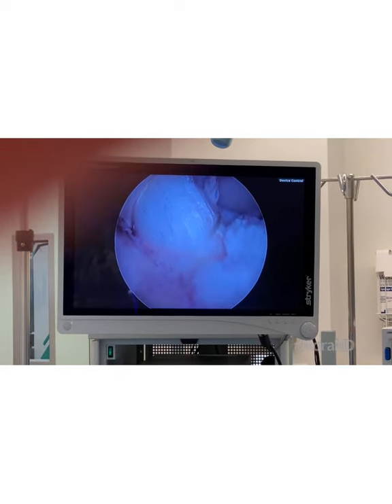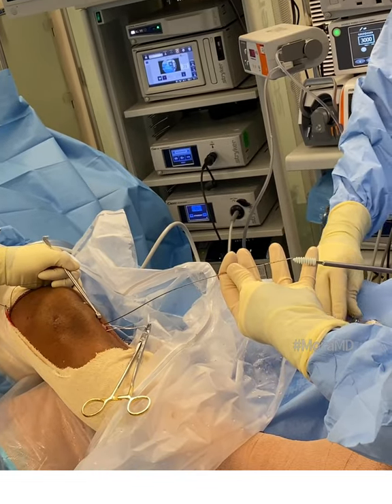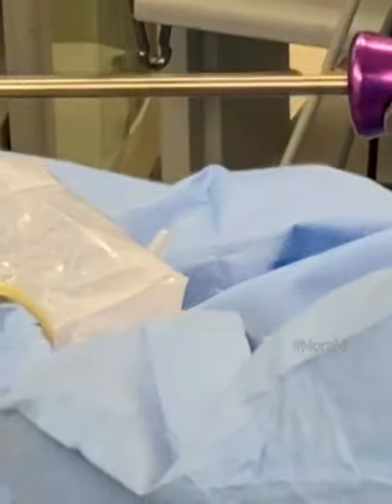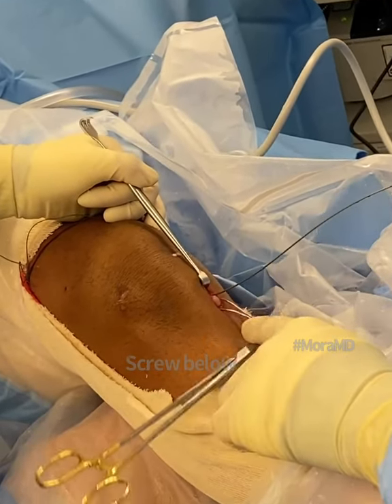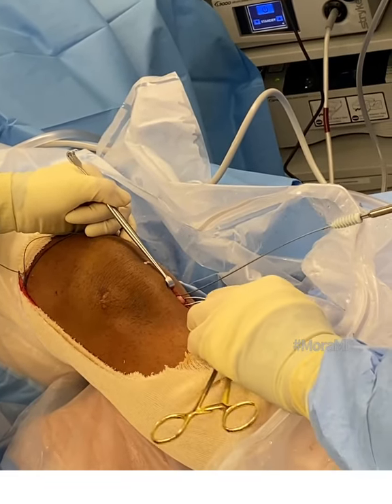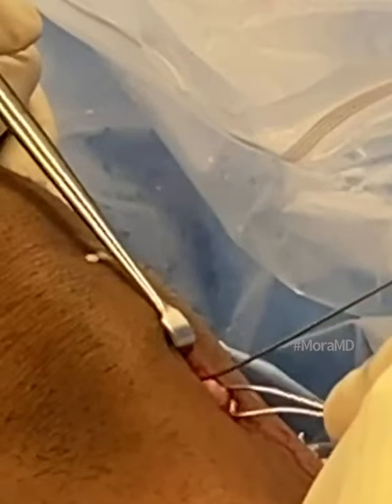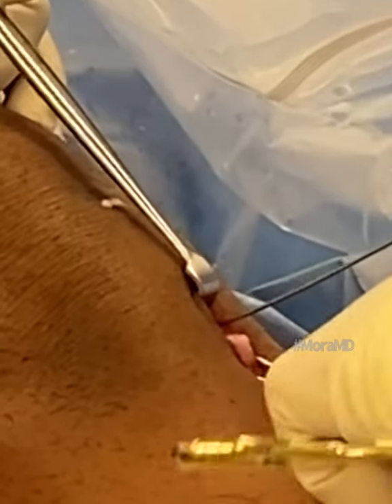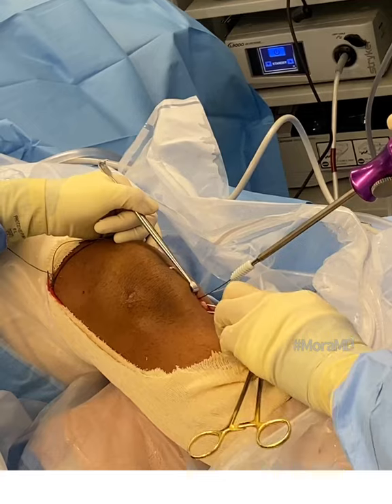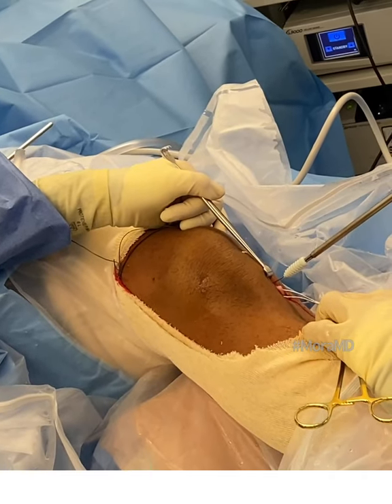The next step would be to lock it into the tibia, but before I do that I need to finish my meniscus repair. What I want you to see here is this clamp holding onto my graft. Some people ask why I use a little wire here to pull my graft — because sometimes the suture can get damaged by the screw or the tap, and if you're using a suture to pull, you may cut through it. So I use a little wire, which I'll take out later. I'm putting in my distal screw, positioning the leg at about 30 degrees of flexion, and locking it in.